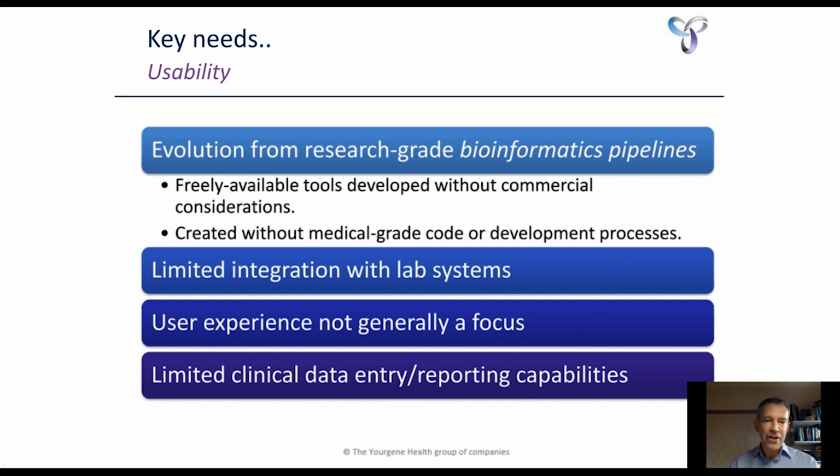User experience was not always a focus, so the focus was on getting a test up and running to begin with, getting the analysis working. Quite rightly, it's on getting it working. It's on showing that it works and that it works reliably. But sometimes the usability of the interface to actually control that analysis has not always kept pace with just how good the system itself is.